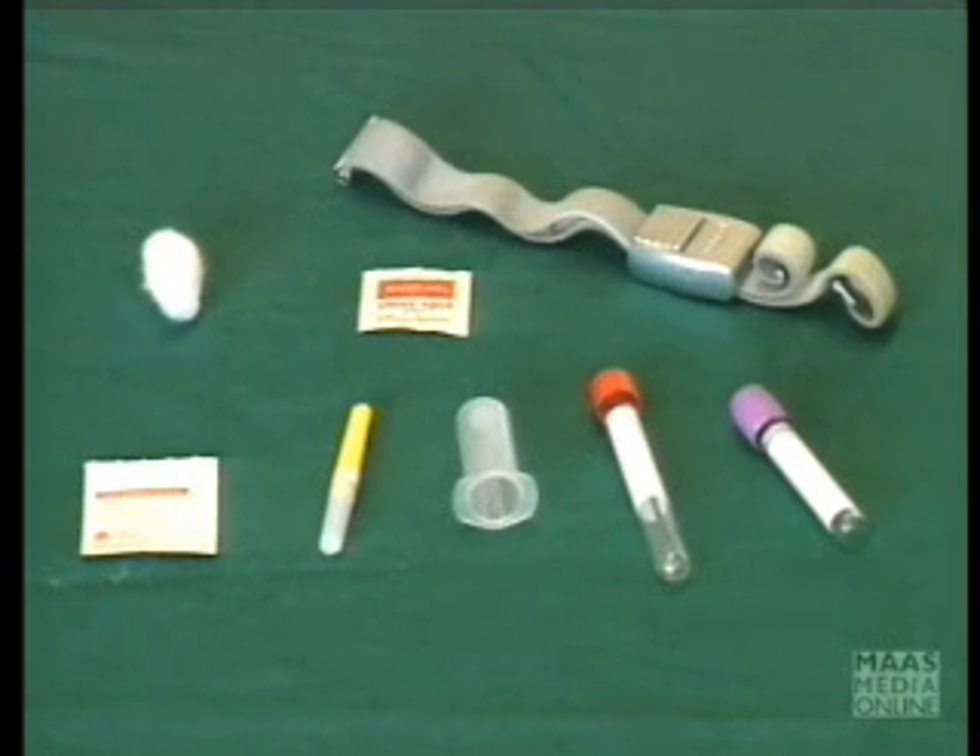In this hospital, most of the blood samples are collected using the vacutainer system. On the table here, we have some basic equipment which is going to be required for collecting blood by the vacutainer system.